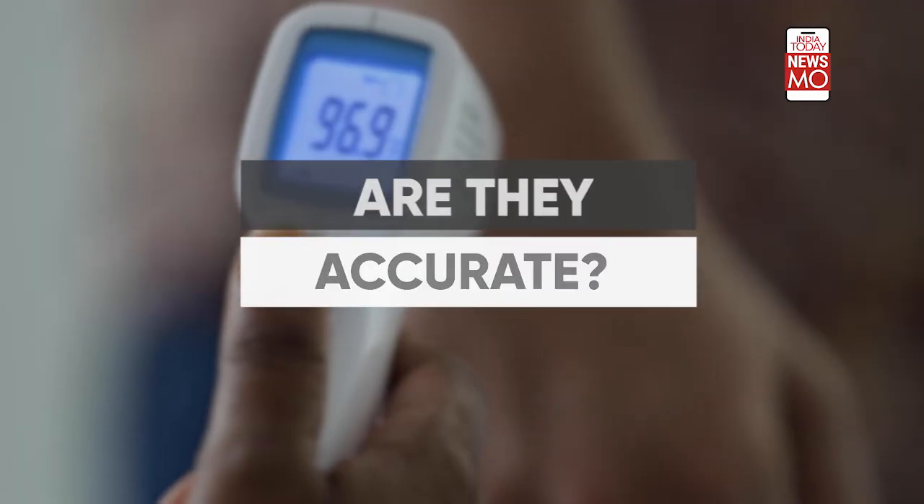It is the safest bet at the moment. Regarding accuracy: with a traditional thermometer placed in the mouth, 98.4 degrees Fahrenheit is considered normal. But when noting temperature using this device, a degree or two lesser than that is also considered normal — 98.4 on this device would indicate fever. As for overall accuracy, there needs to be more study on it. It cannot be considered conclusive evidence of whether you are infected with COVID or have a fever, but it does help you get a decent idea about your body temperature.